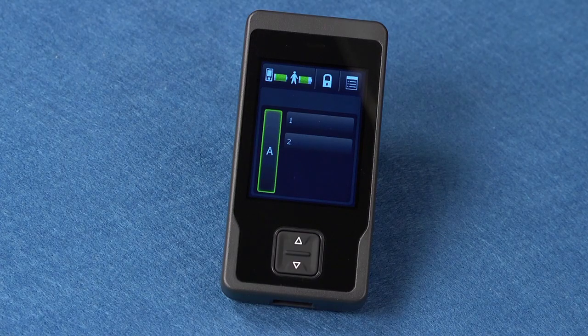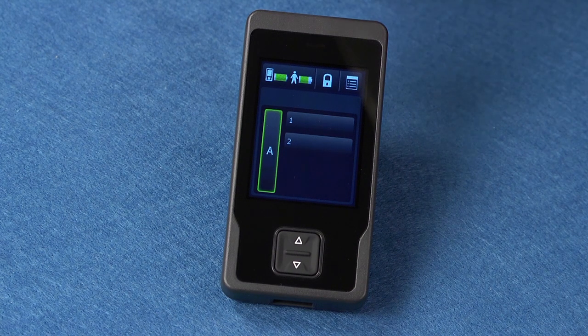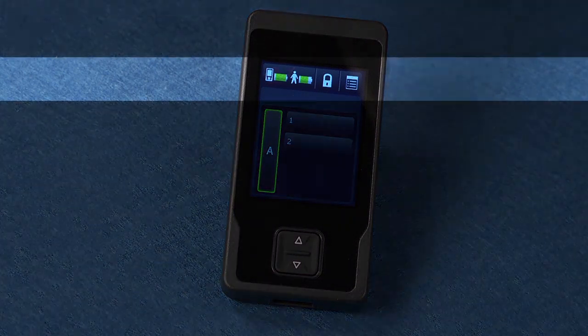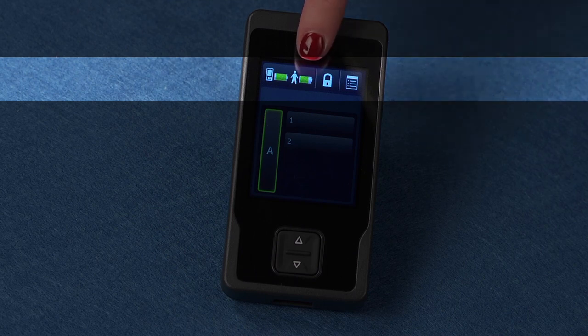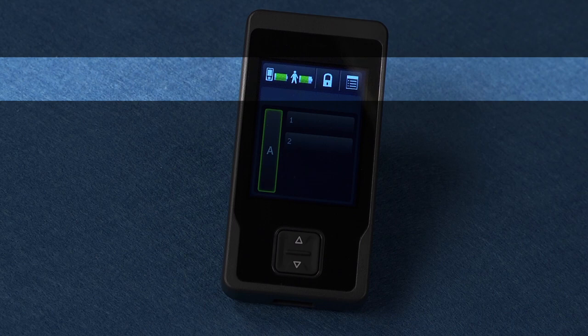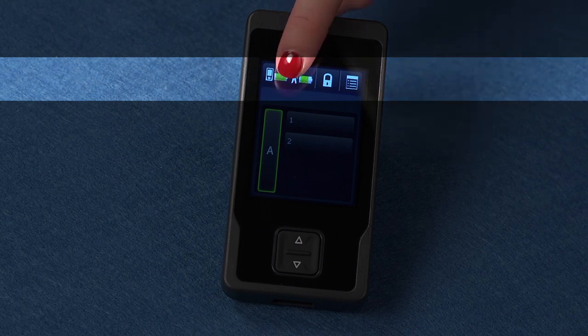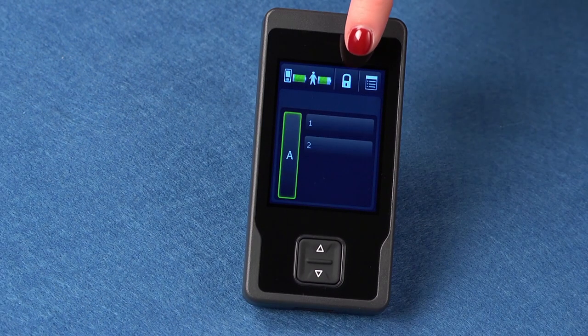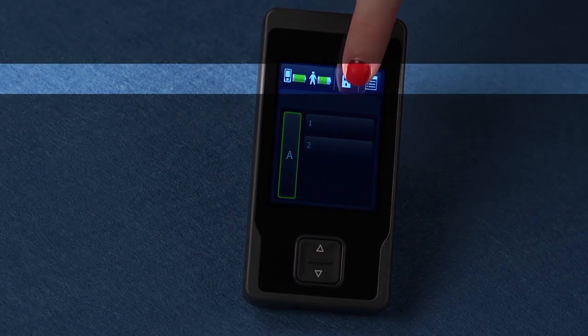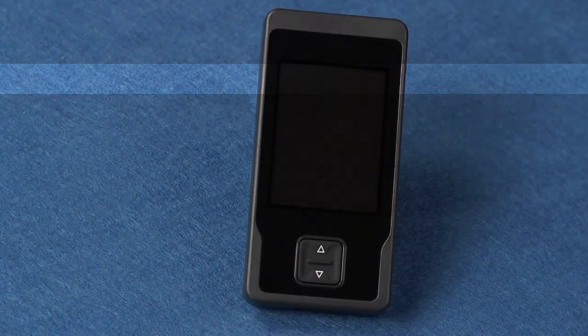Now let's walk through an overview of the therapy screen and what each button means. This is the battery status button. The left icon on this button displays the programmer battery level. The right icon displays your implanted neurostimulator battery level. Press this button to check the battery level. Here is the lock button. Press this button to lock your programmer after using.